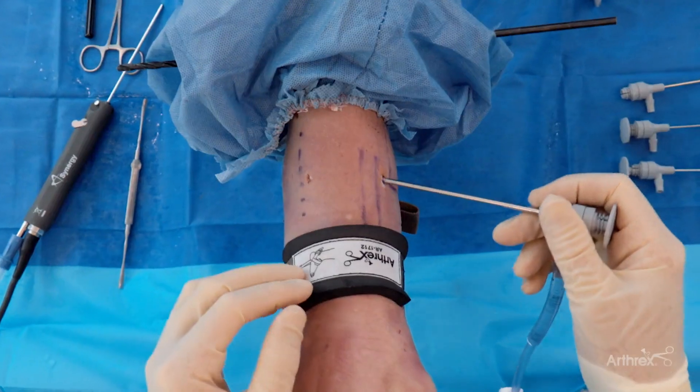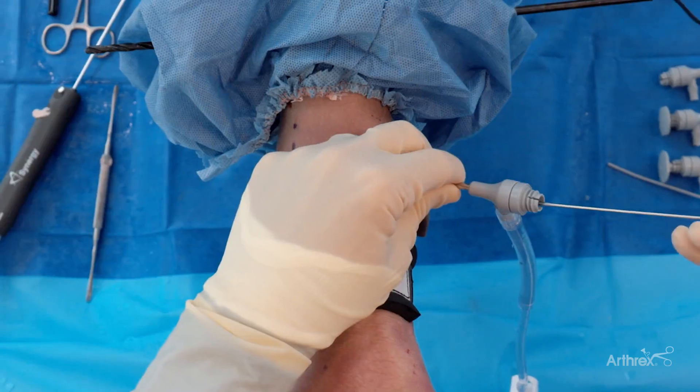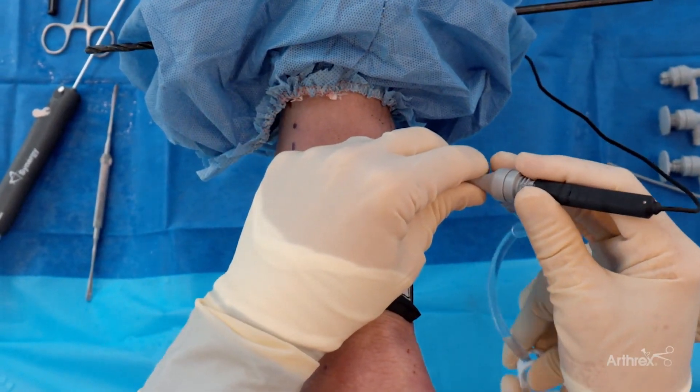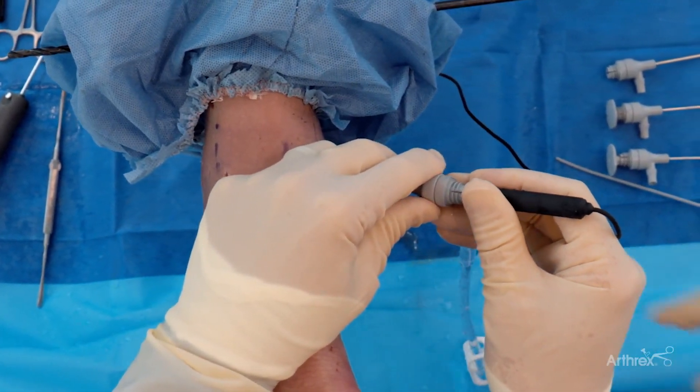We're using the high flow sheath. We'll remove this and insert our Nano needle. It does kind of click into position. We'll turn on our fluid, and we'll look around a little bit and show you guys a couple things here.